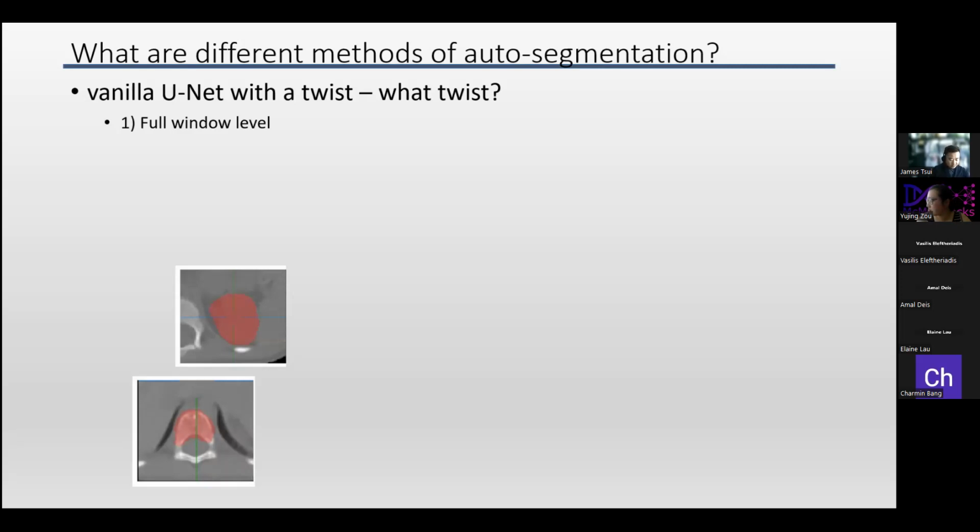Now, nnU-Net is doing multi-class segmentation, and you're interested in all the organs of the body, so your Hounsfield unit range is super large because you want to account for all of that. In nnU-Net, they do some normalization. They clip the values to the 0.5th to 99.5th percentile within the mask, if memory serves me well. But if you're doing organ-specific work, you don't need that big a range. What you're really interested in is what's inside a mask and maybe a 2 mm rim around it.